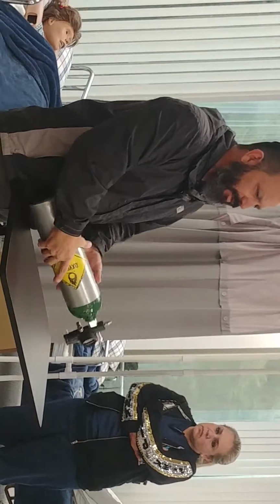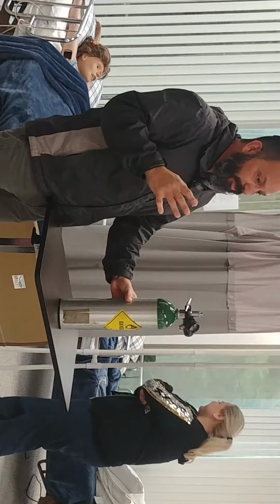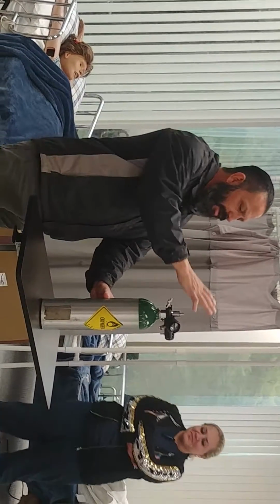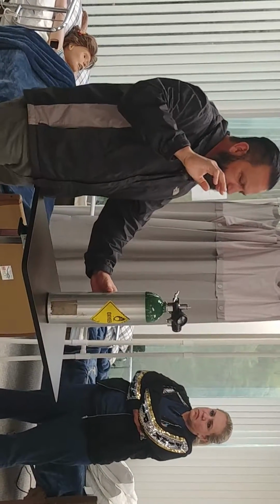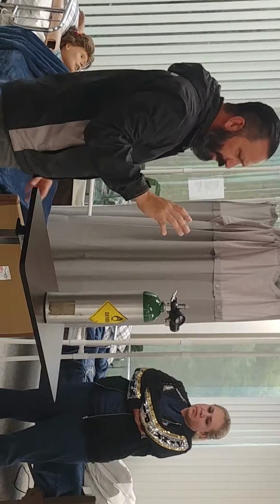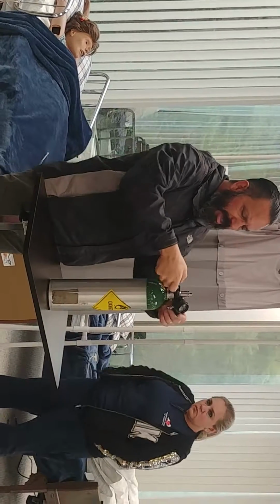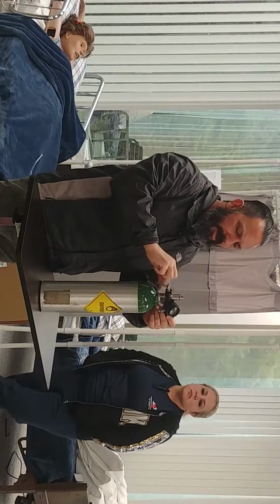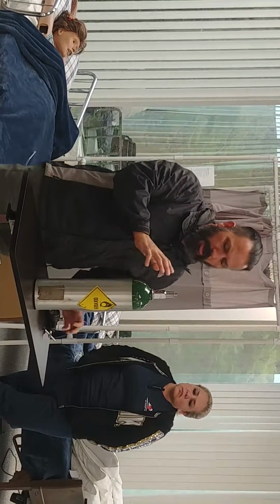You can't just say, okay, I'm done with this, let me throw it in the back of the ambulance. This is under high pressurization. I've seen one time in my career where the stem was broken and this thing became a projectile. Pretty gnarly, very dangerous. So make sure we store these correctly. We need to inspect the bottle every time. They don't come with regulators on them, but we need to make sure there are no dents, no dings, and everything is intact.